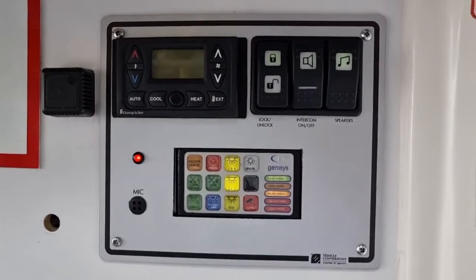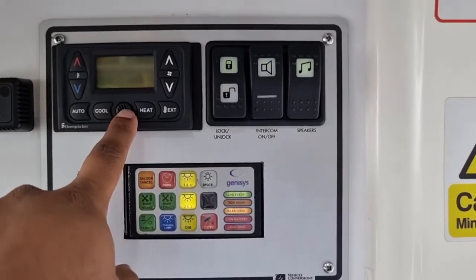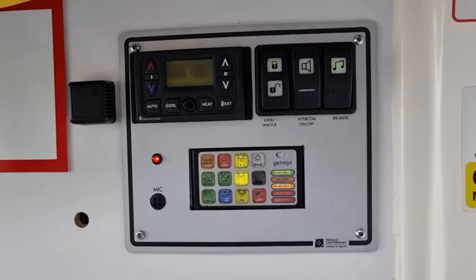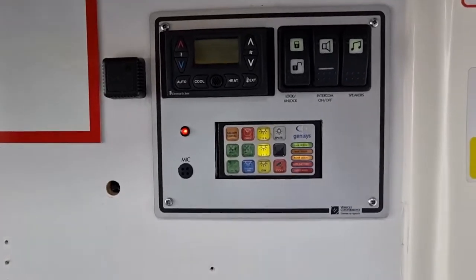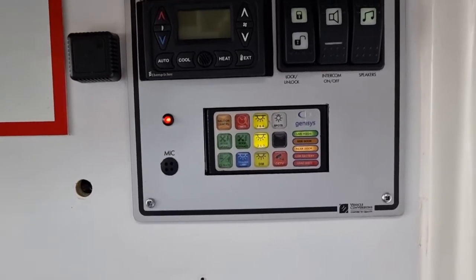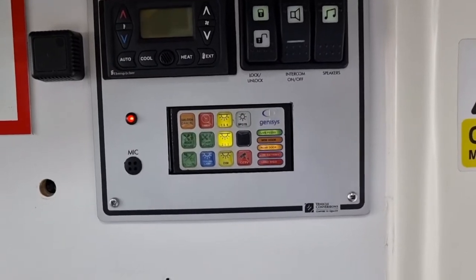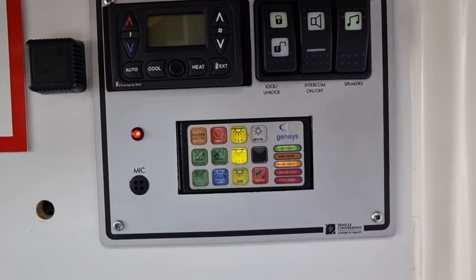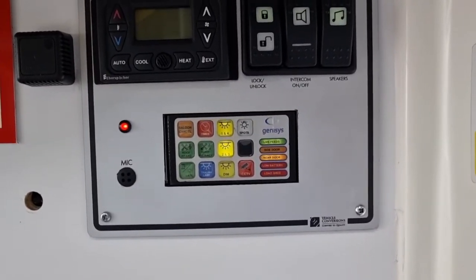Guys, one more thing that I've been asked by lots of the people here when they came to see the ambulance is whether this has a temperature control, because what I've been told is that as soon as there's an accident and the patient is waiting for the ambulance, hypothermia sets in. So this ambulance has a feature where you can increase the temperature inside the ambulance so that the patient feels very warm.